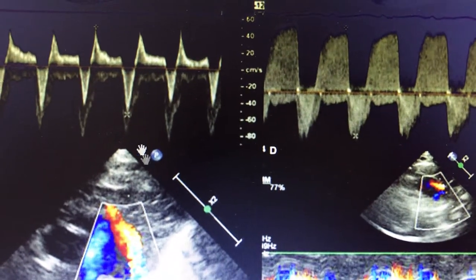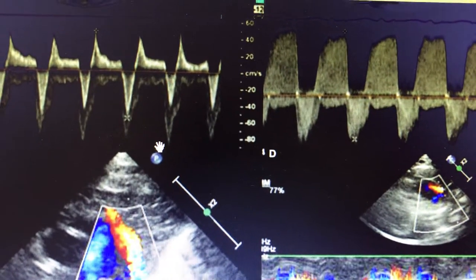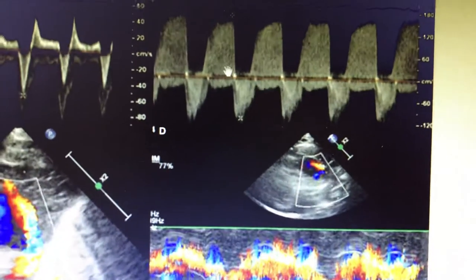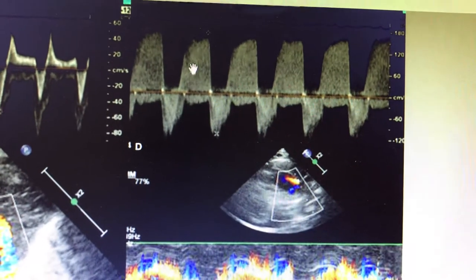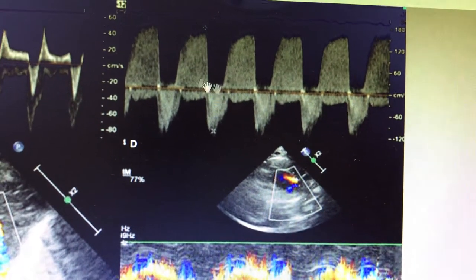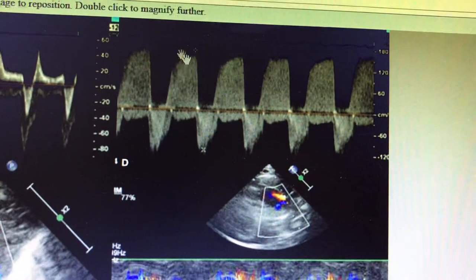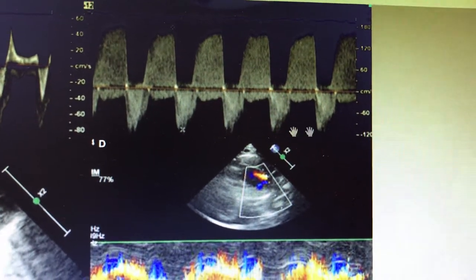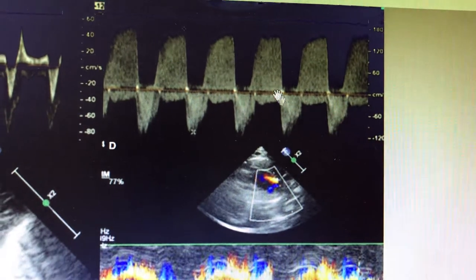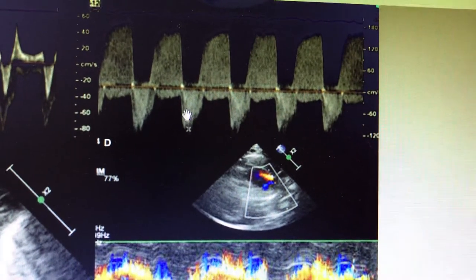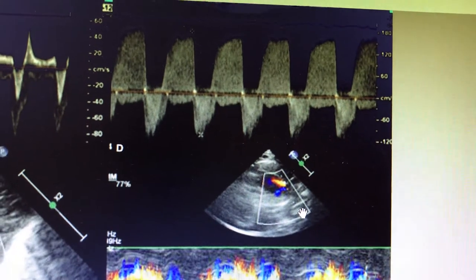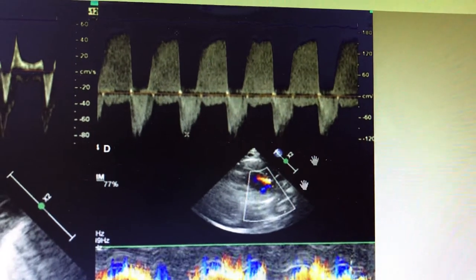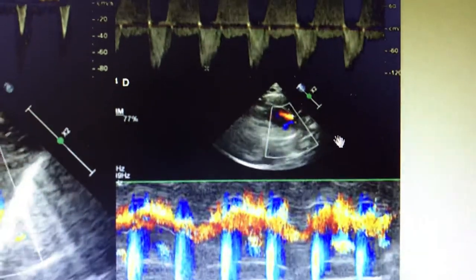The pulmonary artery is also getting the same amount of cardiac output as the aorta. Throughout the diastole the blood is getting inside the pulmonary circulation. There is a huge gradient — predominantly left to right — you can see it is going up to 180, whereas during systole it is not even reaching 60. During systole there is slight reversal of blood into the descending aorta, but throughout the diastole and most of the systole the blood flow is towards the pulmonary artery — predominantly a left-to-right shunt.